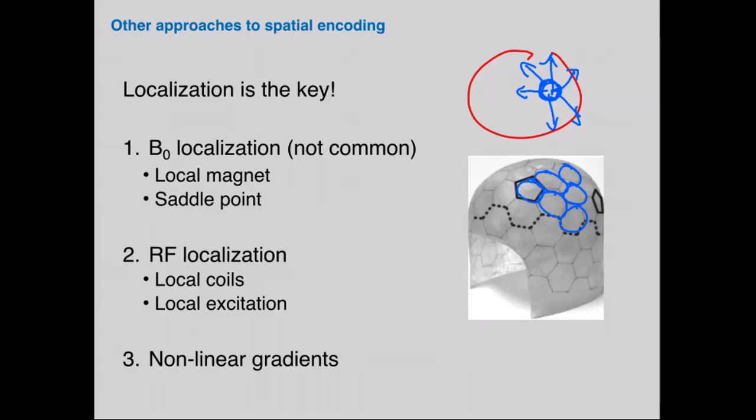Now, on the top of the head, a small coil would be perpendicular to Z. Would it be worth putting one there? Yes, it does, but again, there's a subtlety there. Yeah, I'll get to that when it makes sense.